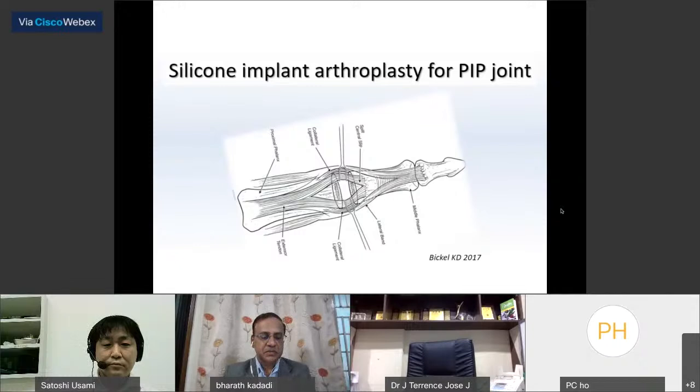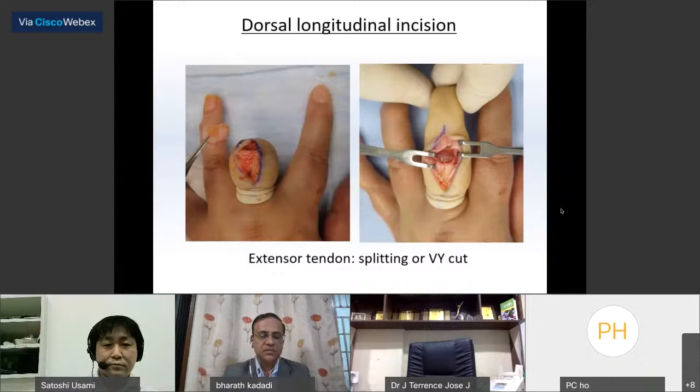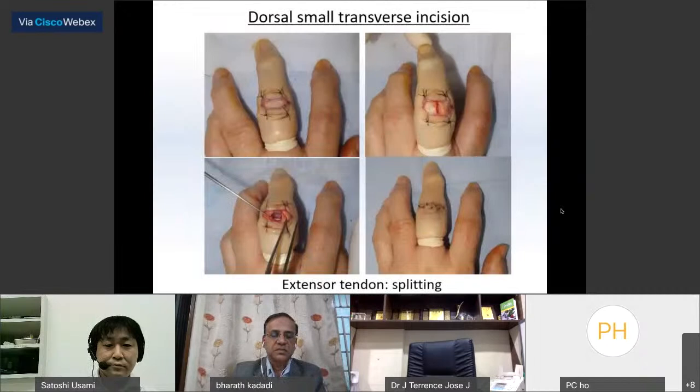Usually, we select the dorsal approach with a dorsal longitudinal incision for the replacement of osteoarthritis of the PIP joint. I believe the dorsal approach is simple and reliable, and moreover less invasive to soft tissue than the volar approach. Recently, I sometimes use a small transverse incision with extensor tendon splitting. This approach is appropriate for the PIP joint without severe osteoarthritis and is less invasive than the conventional dorsal approach. Unfortunately, for now, we cannot strongly recommend this approach because there are few clinical cases and outcomes.